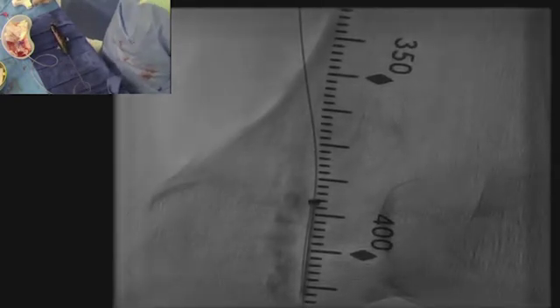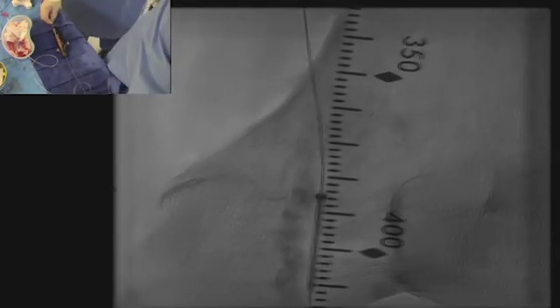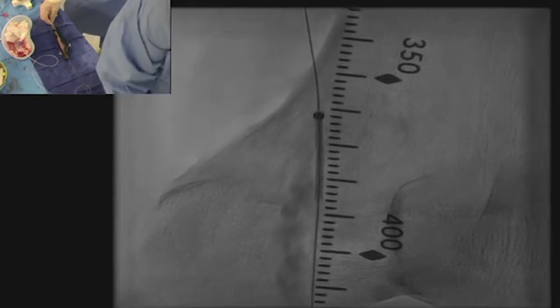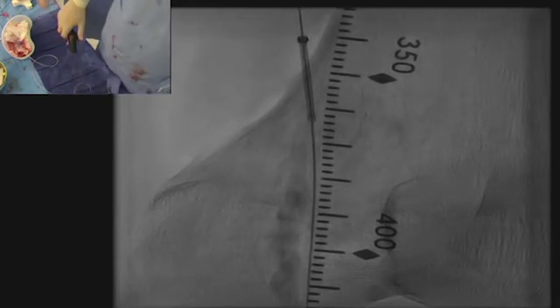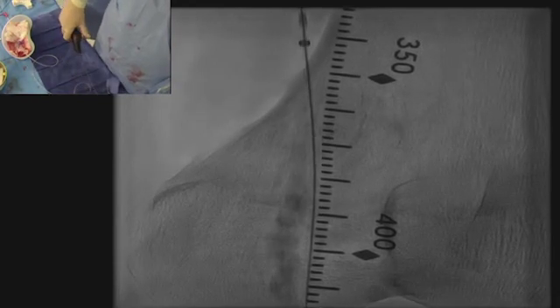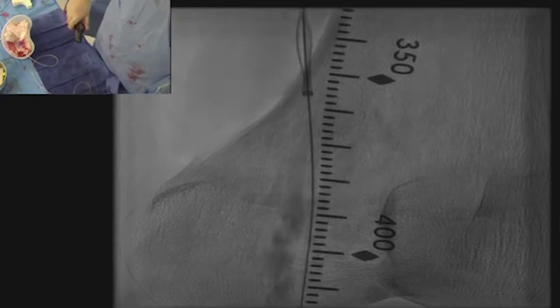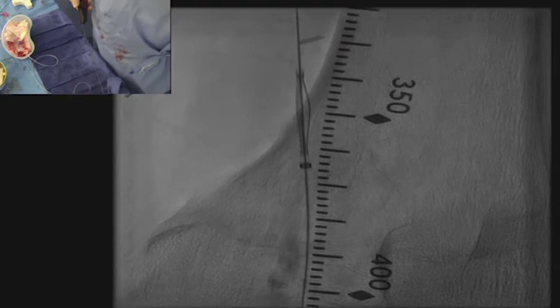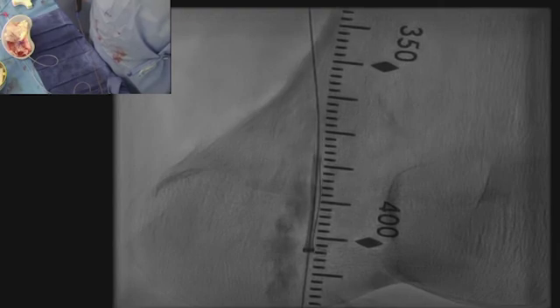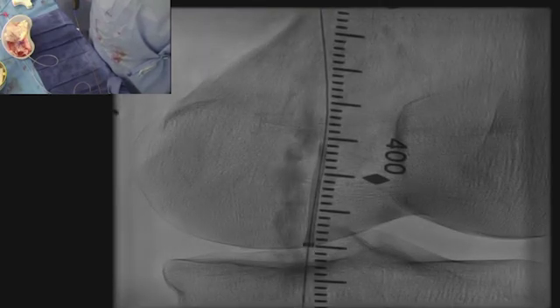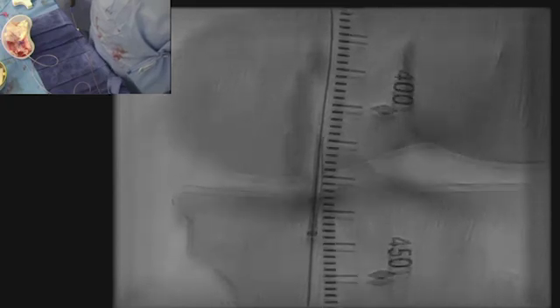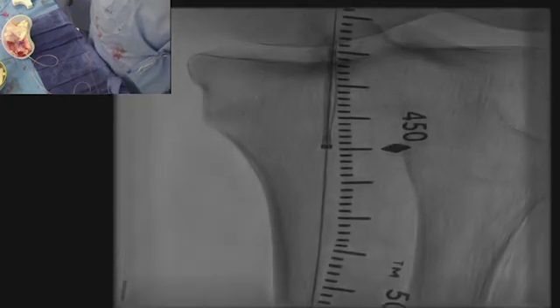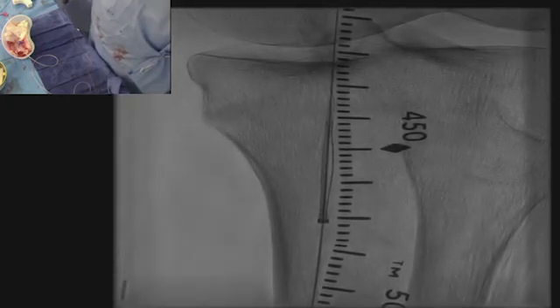Now we retrieve the device into its housing, and we're going to re-advance it because we notice multiple areas of severe flexing in. We're going to go back and deploy above the area that we're going to treat. Now it's coming in, flexed out. We rotated the device, as you can see, because we're going to treat different areas that we haven't treated. Now we're going to see what's going to happen in the area where it flexed in earlier.